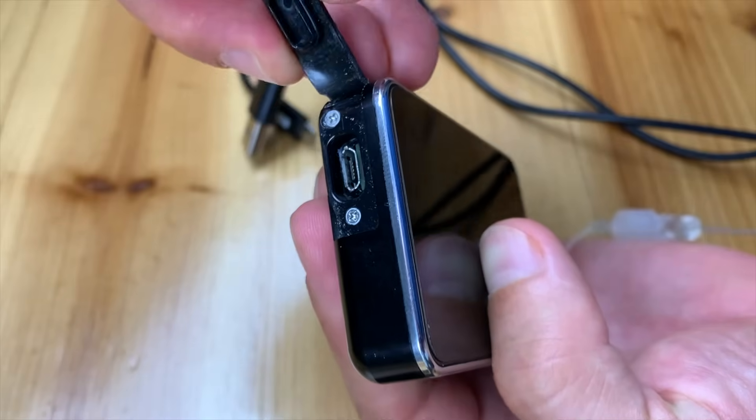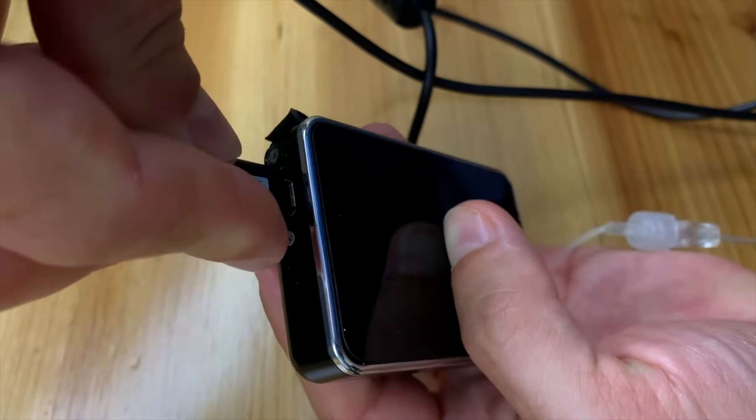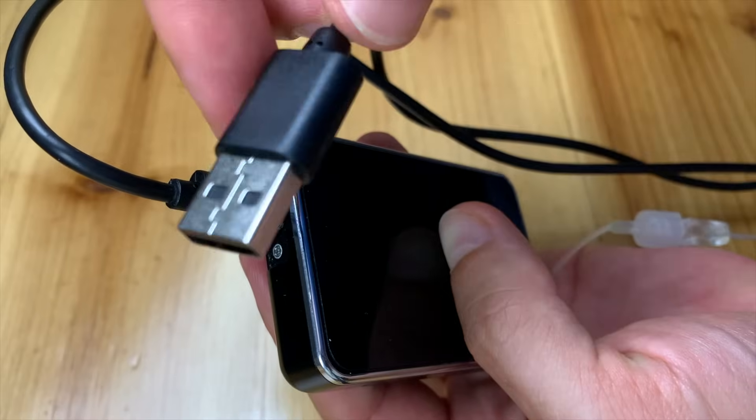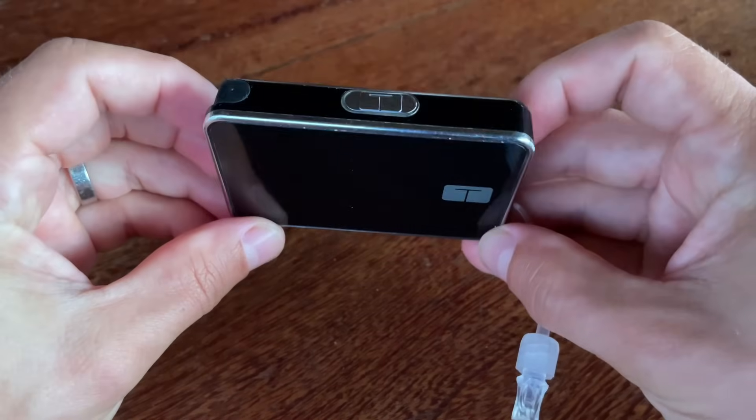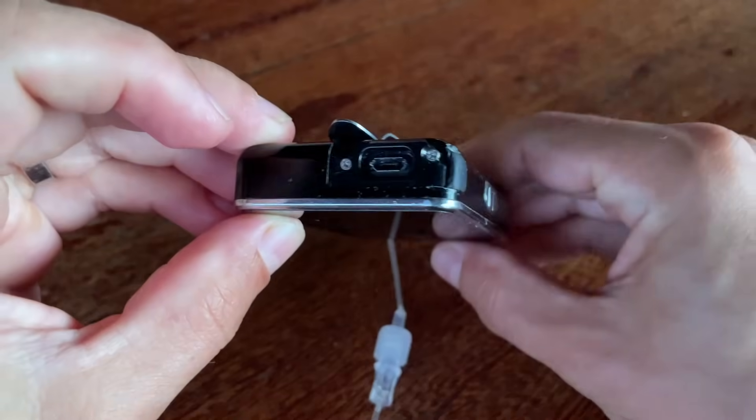The battery is another area where Tandem has saved space, because the T-Slim has a rechargeable battery that you can charge with a USB charger anytime. But again it has its pros and cons. The main pro is that the pump can be smaller and it's more environmentally friendly.